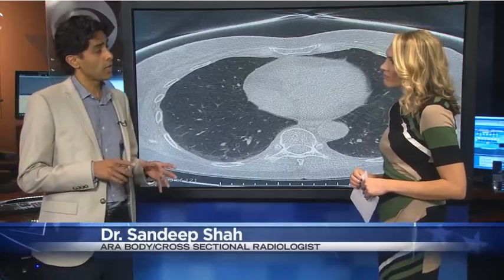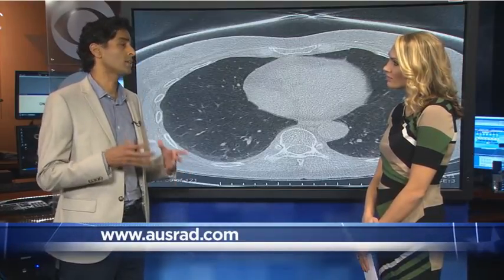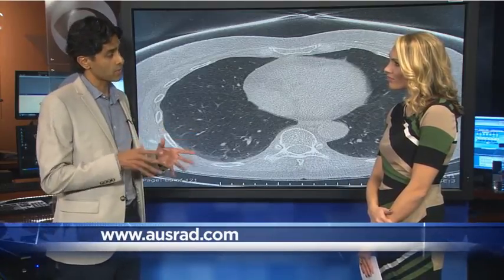So what are we focusing on today? CT lung screening. Okay, what exactly does that mean? This is a diagnostic test that we use to look for potential cancerous nodules in patients before they actually have any symptoms of lung cancer. That's important because lung cancer causes the most cancer deaths for both men and women. So we use this lung screening test to proactively look for potential cancer in what's called a high-risk population. Who is it recommended for? Smokers mostly. That matters because 90% of lung cancers are believed to be attributable to smoking.